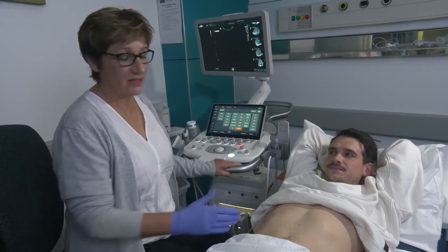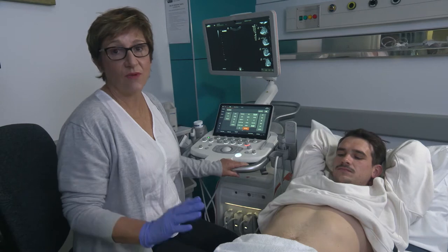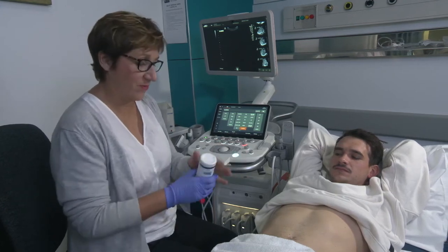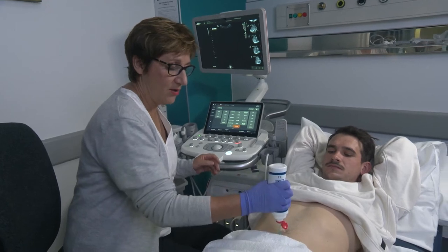This is Bruce, our patient for today. We're going to begin by assessing his bladder. He has arrived for the scan with a full bladder, so for his comfort we will assess that first and then let him go to the bathroom. Beginning by placing gel on his lower abdomen.